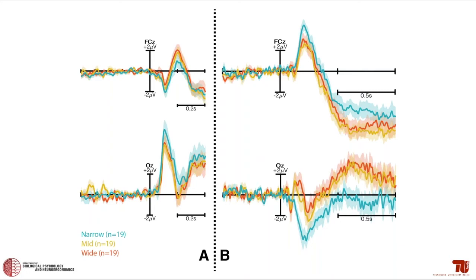After the imperative stimulus to walk through the door, clear differences appeared in both occipital cortex activity and frontal-central leads — the supplementary premotor area. Importantly, at the same early time point when differences appeared in visual cortex, differences already emerged in motor and premotor areas. We interpret this as reflecting affordance — the ability to interact based on physical abilities and the given environment — suggesting that affordances impact perception, and that there is no strictly sequential visual-to-motor processing but rather an interaction of motor plans with perception at very early stages.